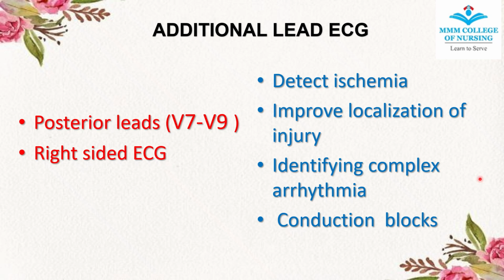These additional ECG recordings help us in enhancing the diagnostic accuracy of myocardial infarction. These additional leads help us in detecting the ischemic changes, improve the localization of the injury that happened to the myocardium, and assist in identifying complex arrhythmias and conductive blocks.